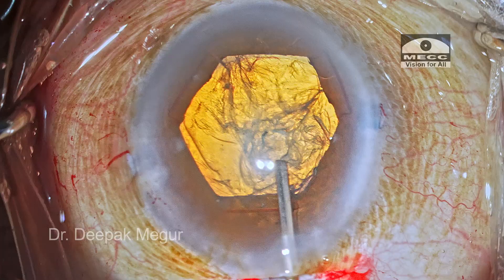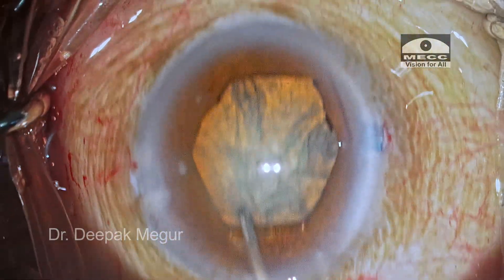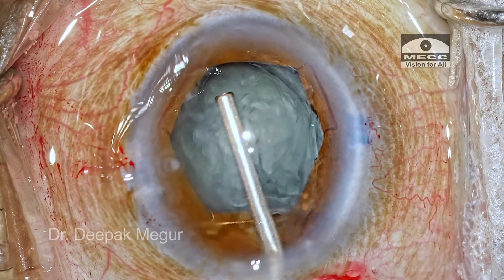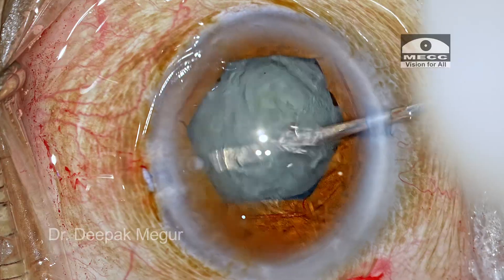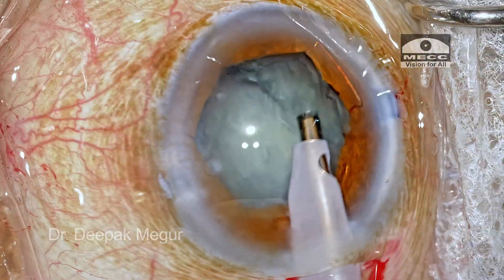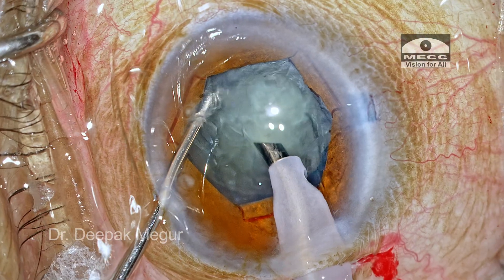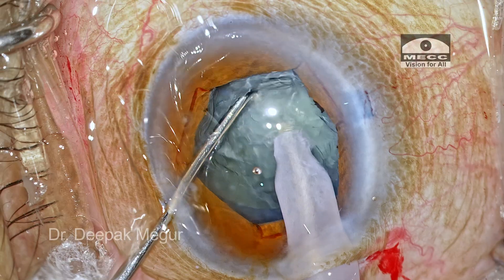A good hydrodissection is critical in cases with diffuse zonulopathy, as it helps maneuver the nucleus without inducing stress on the zonules. Time to phaco. The superficial epinucleus is aspirated out. Time to perform the vertical chop — the tip is buried into the substance of the nucleus, and I'm going to use a sharp vertical chopper for the vertical chopping maneuver.